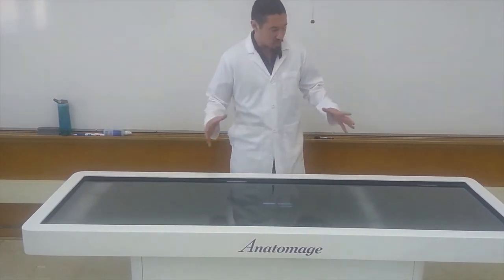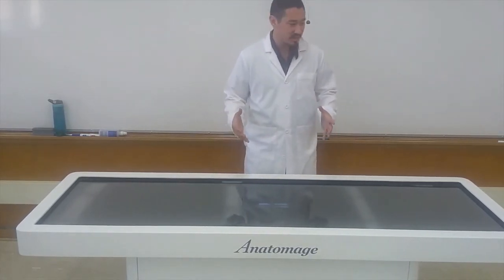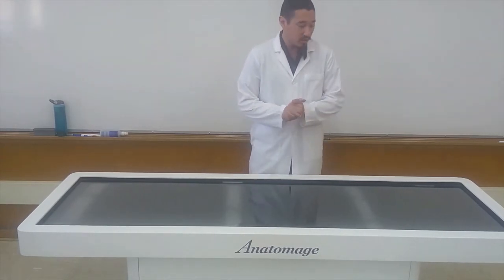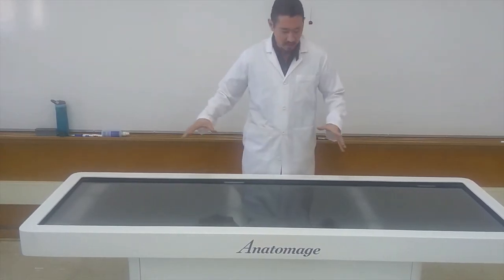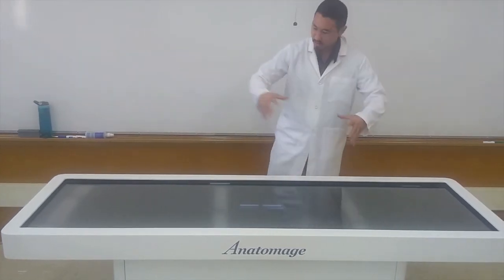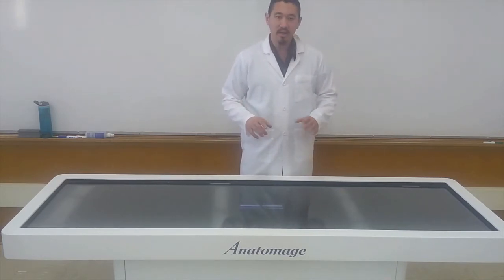Today I wanted to show you our Anatomage table, a really amazing tool that we have access to here specifically for our biomedical program. What this table is, it's a full-size touchscreen. It's something that all the kids can line up around during class, and we have different groups that can come up and manipulate the body.